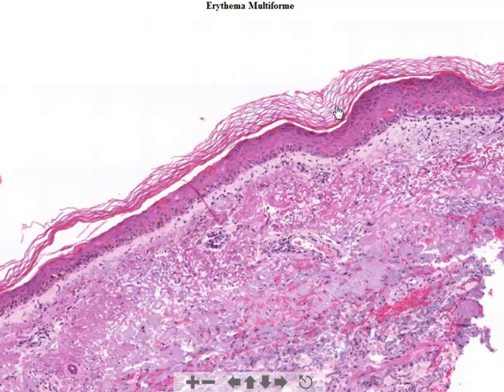Both diseases can be characterized by dyskeratotic keratinocytes, although the presence of these apoptotic or dyskeratotic cells in both the upper and lower epidermis tends to be more characteristic of erythema multiforme. Sometimes pleva can show a significant number of dyskeratotic keratinocytes. However, in pleva, we typically see more of a serum crust present within the stratum corneum. The inflammatory infiltrate tends to be both superficial and deep, and wedge-shaped as well.